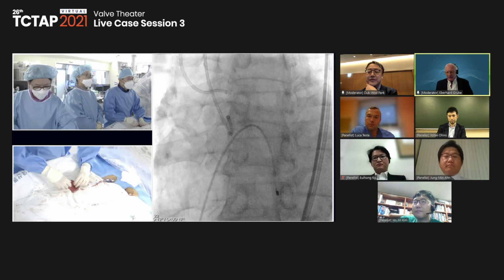If you have a reliable 3D echo or a reliable echo person with a lot of experience, then I would totally rely on 3D echo. We've done a comparative study between CT, MRI, and 3D echo, and they were very comparable. So depending on the patient situation, I would rely on 3D echo. I would not rely on 2D echo, to be honest, but on 3D echo, I would go.